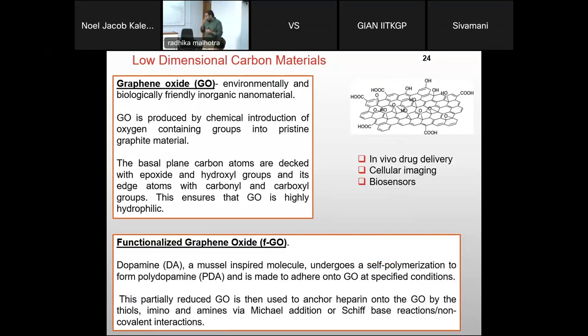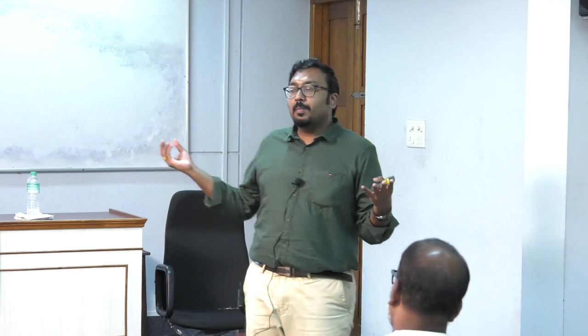So we spoke about the fiber diameters. Do you all remember the fiber diameters? Yes, they are just 100 microns. If you have to graft the inner surface of a 100 to 200 micron inner diameter of your fibers uniformly, it may not be possible. So grafting became out of the question. Using mixed polymers was the next option, where you blend them to form a homogeneous solution which is extruded to form fibers. That is an option.